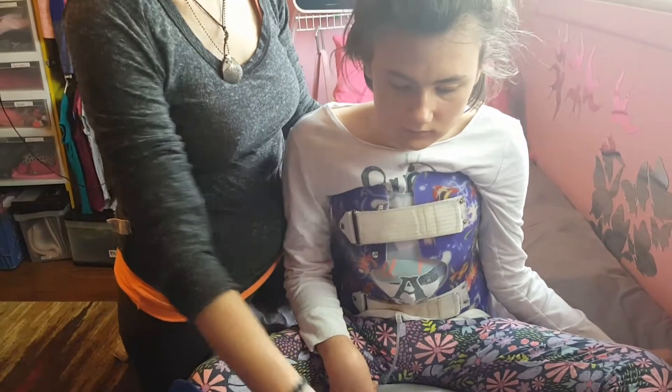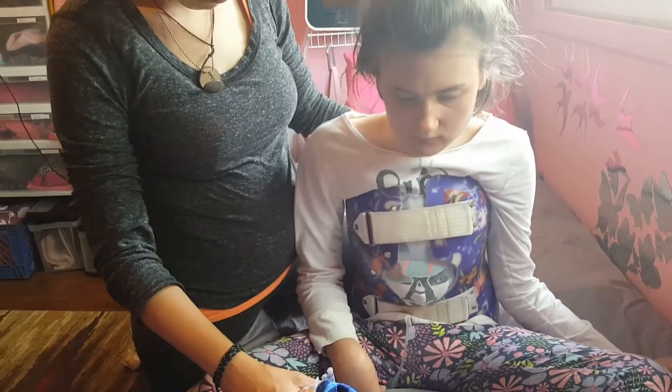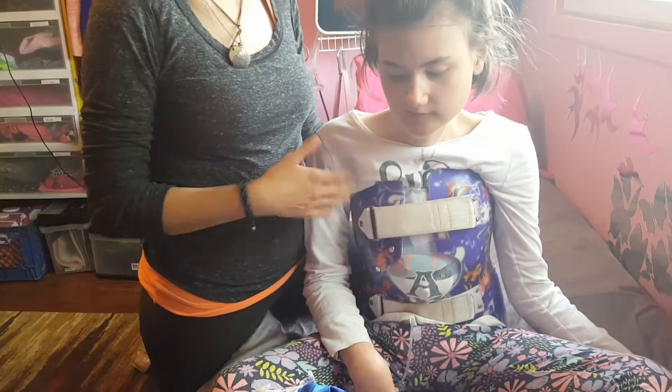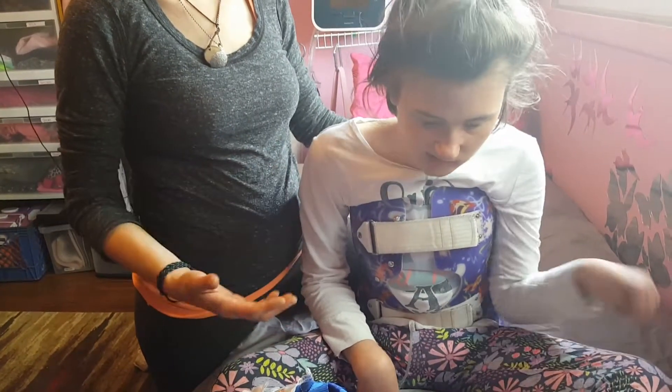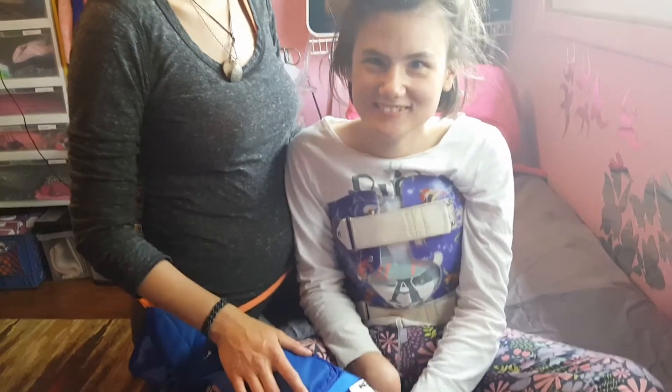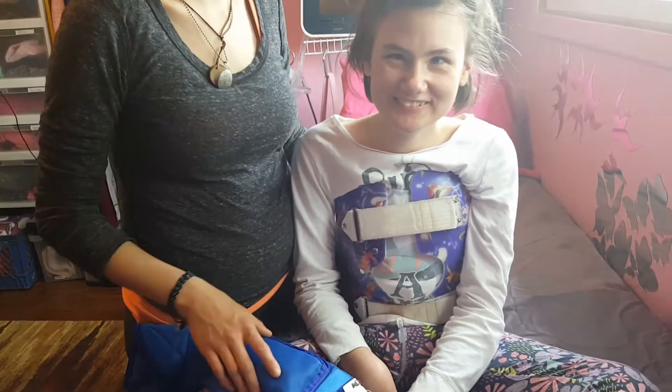All right, YouTubers. Dusty and Isabella back here. So after you get her TLS sew on and you want to get her in her stander or some other upright position, maybe you're going to walk around with her stander, vibration plate. Later on, we'll show you how to get her on the treadmill.